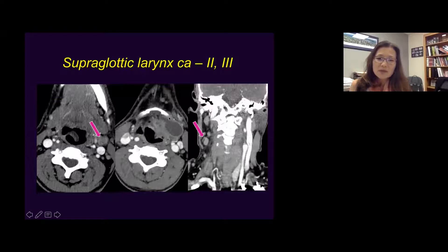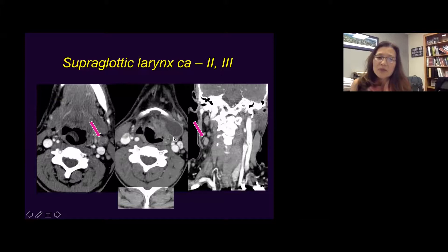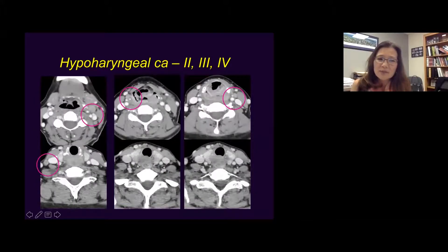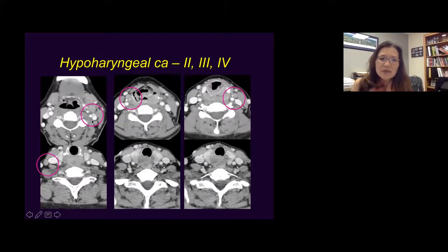Supraglottic larynx cancers can metastasize to bilateral nodal disease. This would be a zone 3 lymph node on the contralateral side. This is a patient with hypopharyngeal carcinoma — notice the enhancing mass starting from the left piriform sinus, extending to the retrocricoid hypopharynx. There is also soft tissue between the vertebral body and the cricoid cartilage. Focus on the lymph nodes: there are bilateral level 3 nodes and a level 4 lymph node — very predictable locations from hypopharyngeal carcinoma.